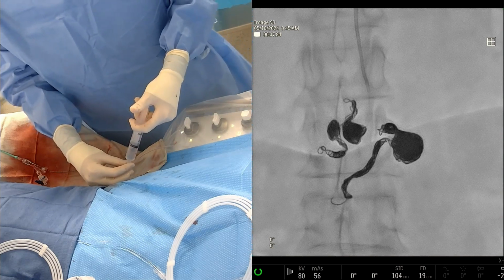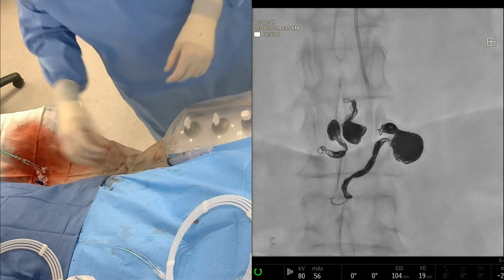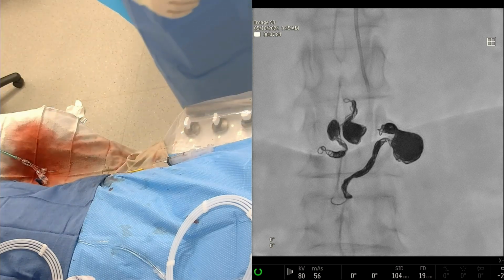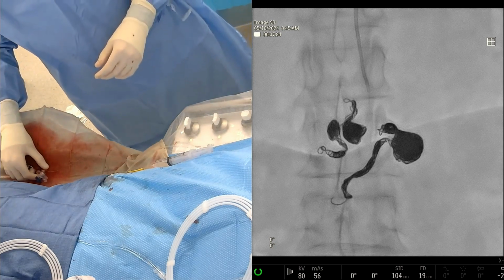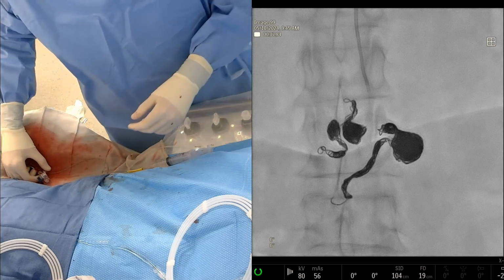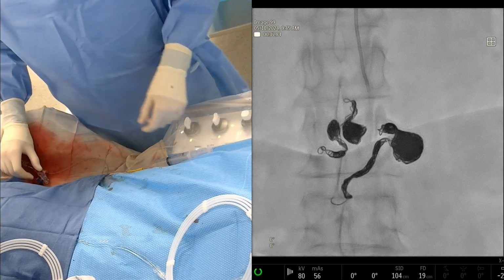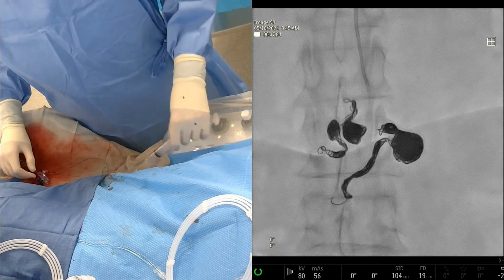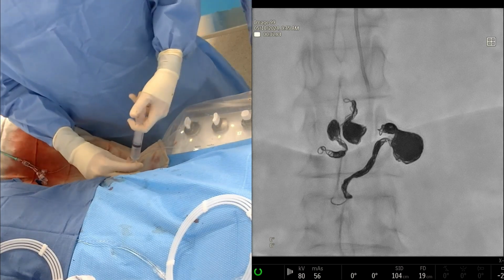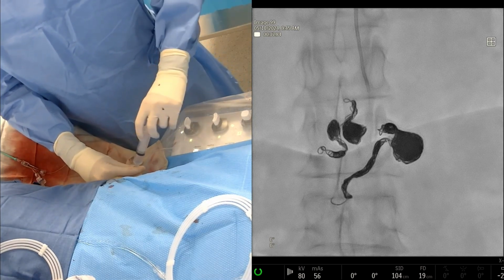Yeah. Hey Tim, have you ever used a pushable? I have, although certainly not for something like this. I've had the hazing of firing in the pushable with the 1cc medallion and all of that. So you have used the pushable. But I will say these are probably the ones I've used more than anything else, including Interlocks. Are we at the inflow coiling portion? Yeah. Cool. Do you want to puff it, or just go for it? Let's see.